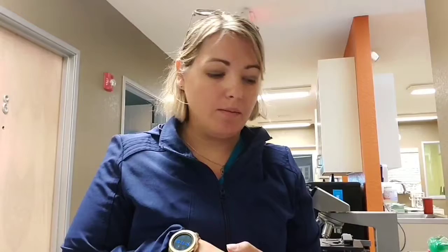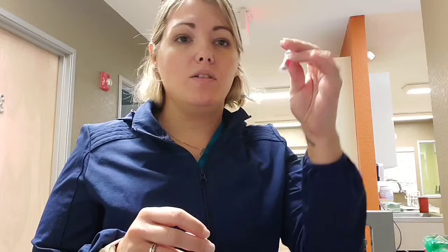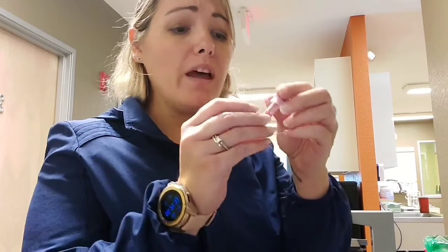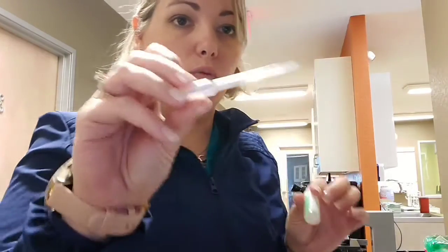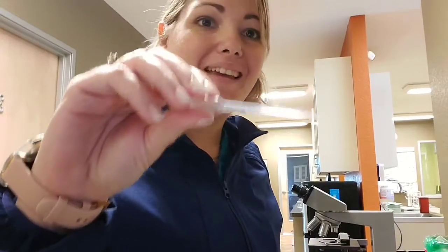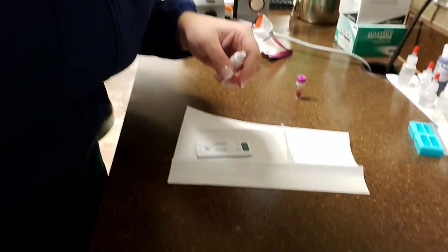All right, so I'm going to be walking you through a serological test. I'm going to be doing an FeLV-FIV Witness test here. It states that you can use whole blood unclotted through EDTA or heparin, as well as serum or plasma. Today I have a sample from my patient of an unclotted EDTA sample. Materials that you'll need would be your sample, your test itself, the buffer, as well as a pipette to take my sample and get that onto my test. I'm just going to drop this down here real quick and show you what we do.